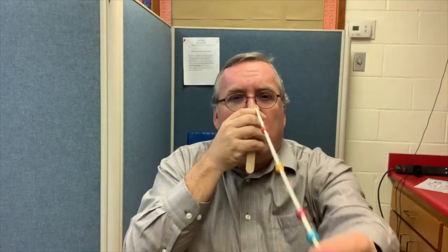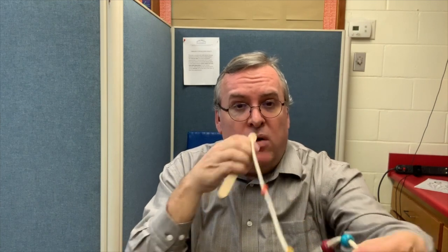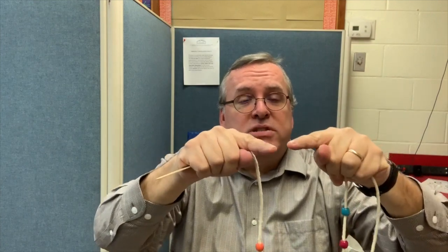When you make your Brock string in your clinic, you'll see this and know what it looks like. We hold it up and have them start at a further-out bead: 'Look at the blue bead for me,' then change focus, 'Look at the yellow bead, look at the blue, look at the yellow.' Their eyes are going to converge and diverge as we switch from target to target.